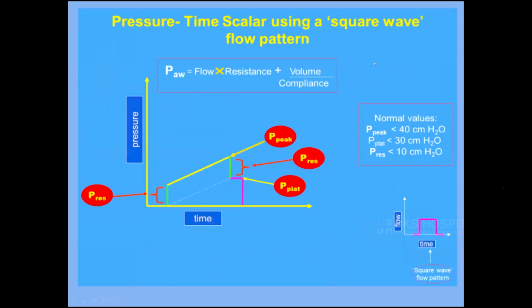So let's look at some of the clinical scenarios, and everyone I'm sure would be aware of the mean airway pressure formula, which details the components that determine it. One is the flow, the other one is the resistance, then the contribution from the lung per se, the alveolar per se, for the unit change in the volume, for the pressure, and the compliance of the unit per se.